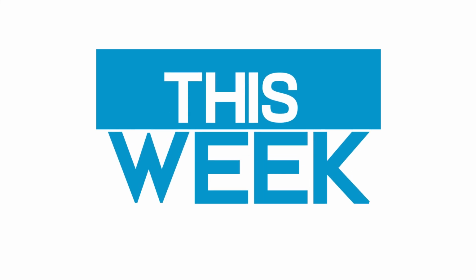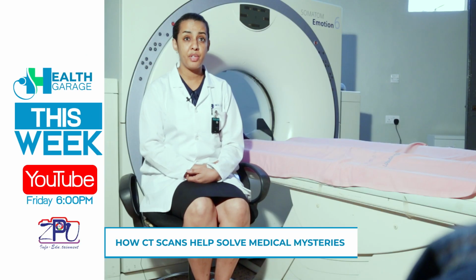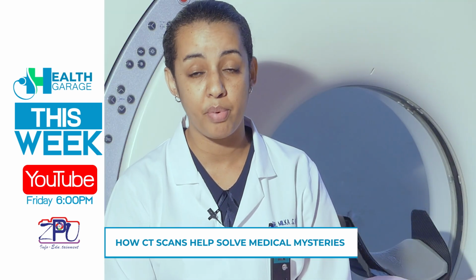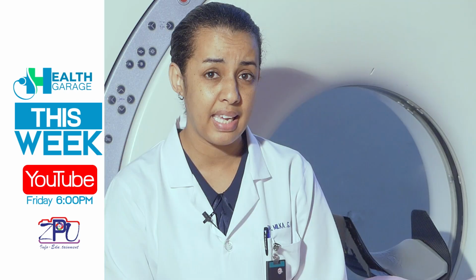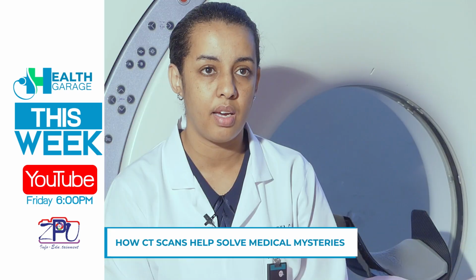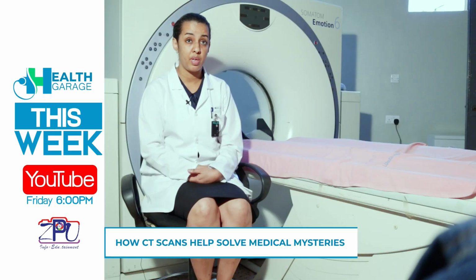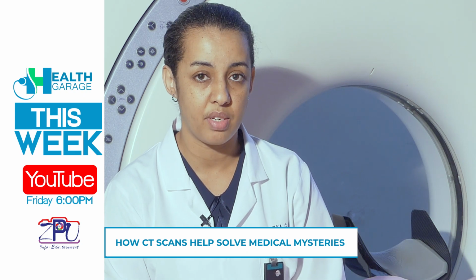This week on Health Garage. The higher the slices a CT scan has, the better resolution, the more accurate the images are, the more precise the images are. So each body part can go through different applications and we get the specific information we are looking for depending on the clinical condition of the patient.